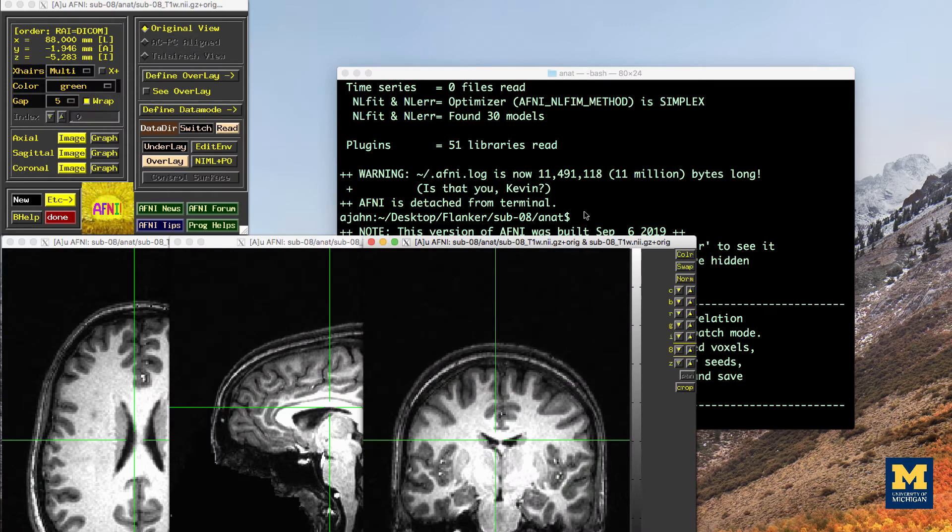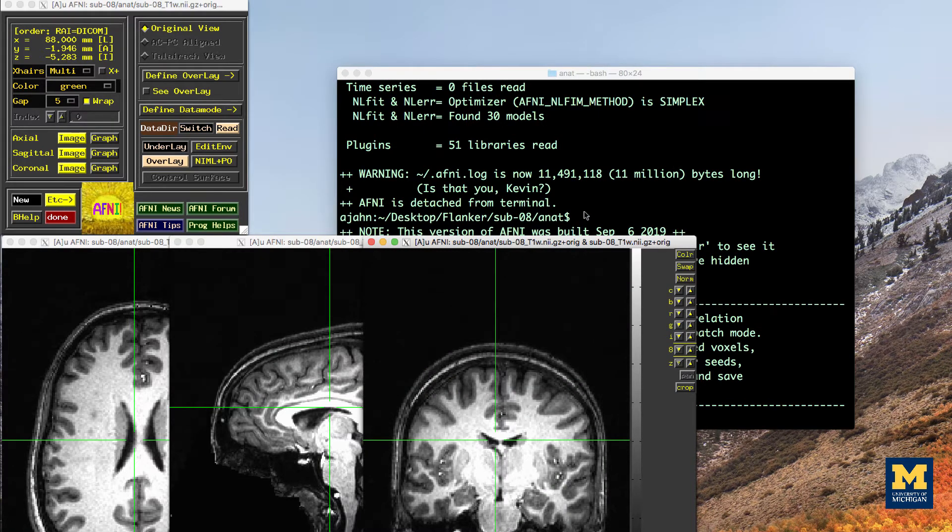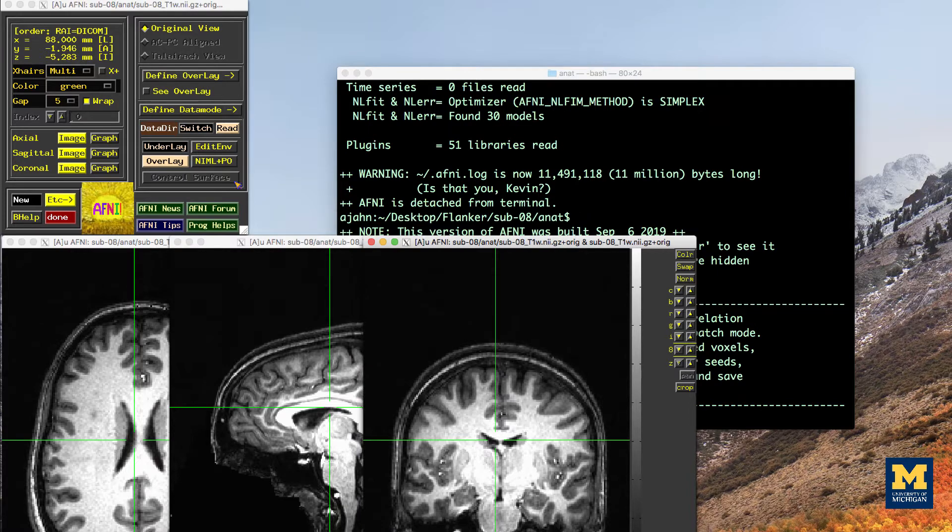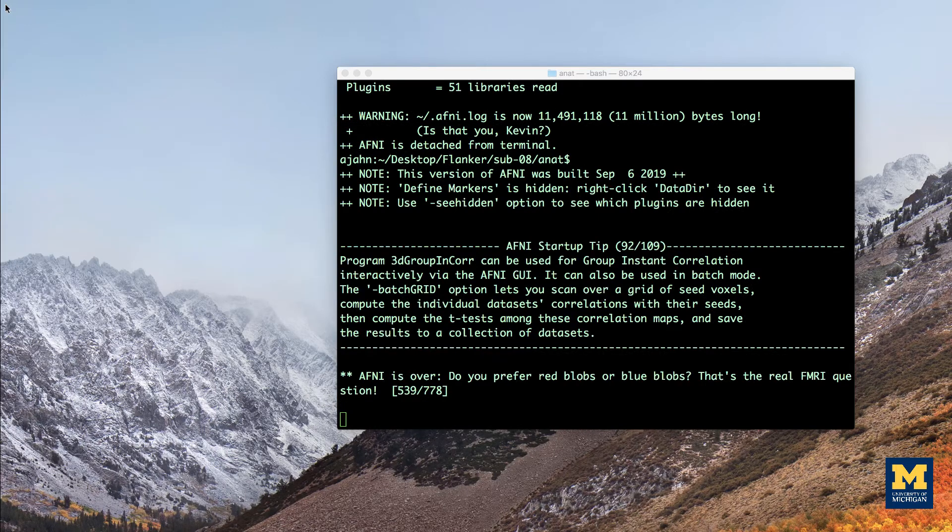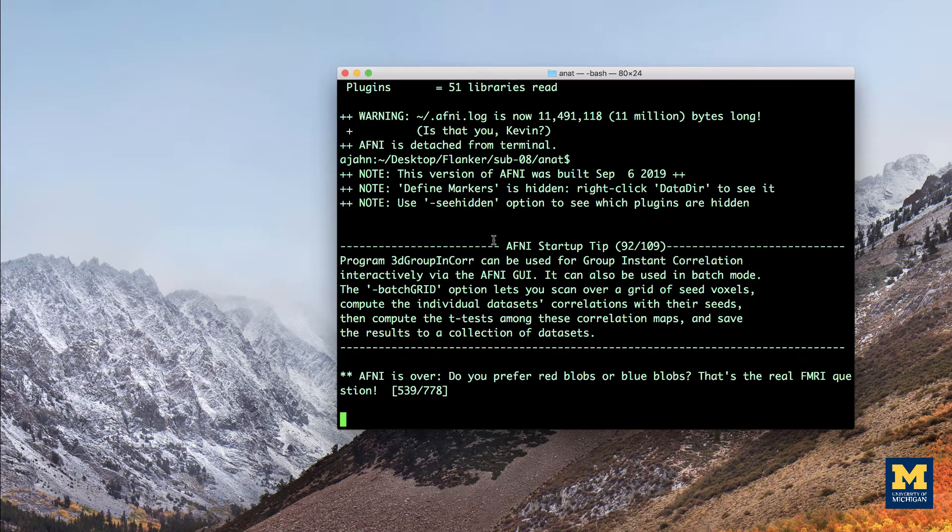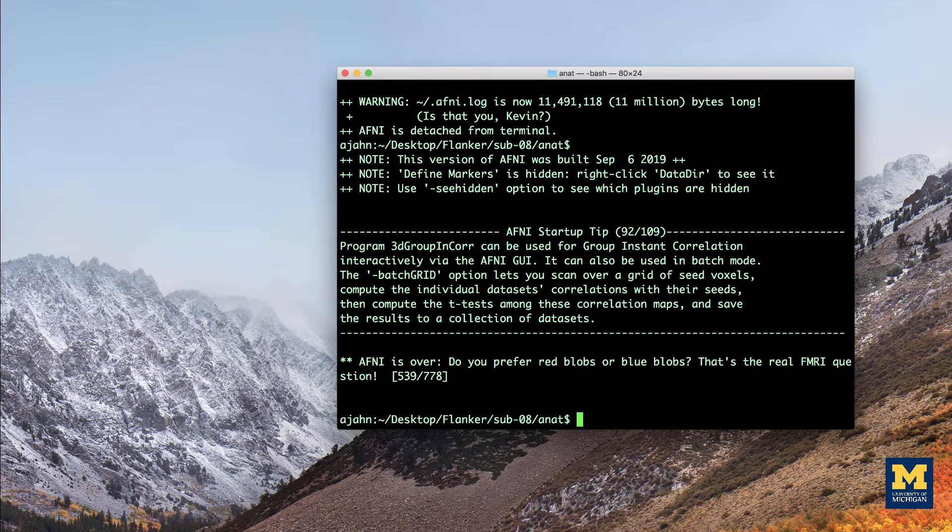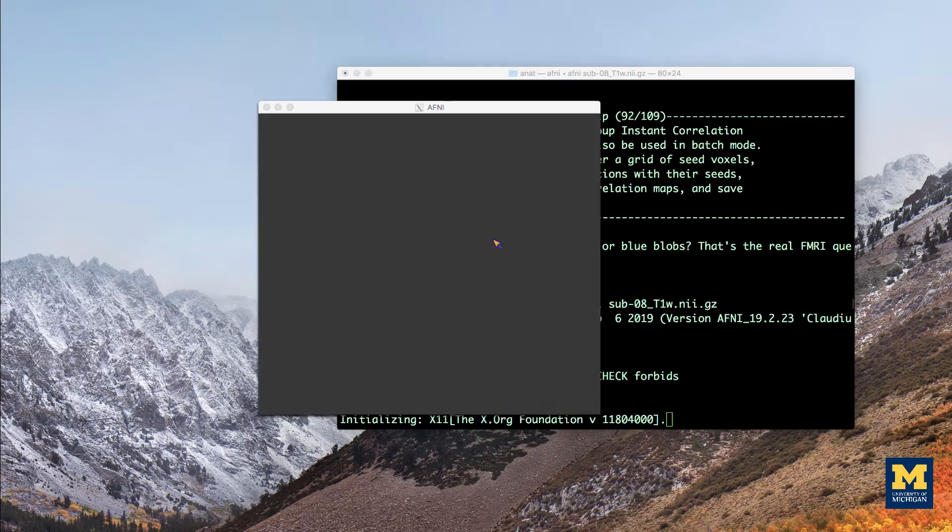By default, AFNI will look for any images in the current directory, such as files in nifty or analyzed format, and load all of them into memory. If there are several other images in the current directory, for example, you wanted to load only the anatomical image into the AFNI viewer, you could type AFNI followed by the name of the image you want to load.